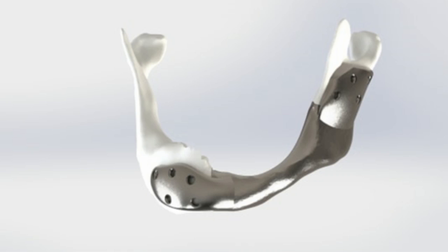The jaw was completely reconstructed based on the patient's 3D MRI and CT scans. The operation was successful.